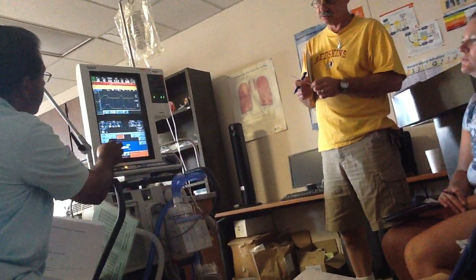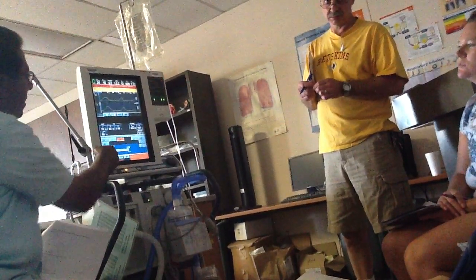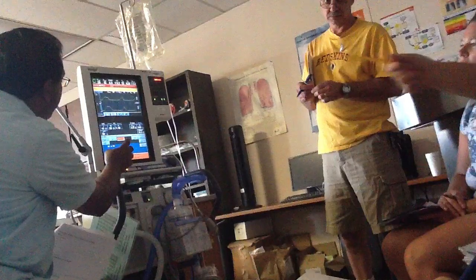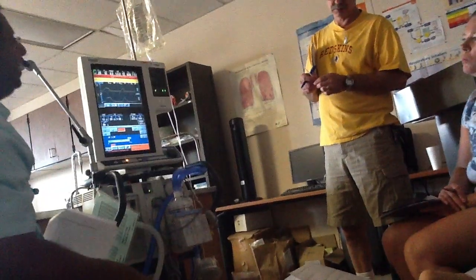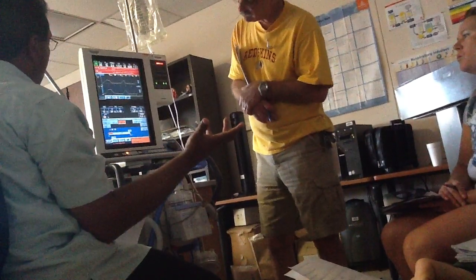When you push this, it shows the TI up there. See, it's unlocked, IE ratio now. See that unlock button pointing down to the IE ratio? And it changes that to say TI instead, and then when you lock it, it goes to IE. Yeah, exactly. So right there, IE locked. Or you can have just TI locked.